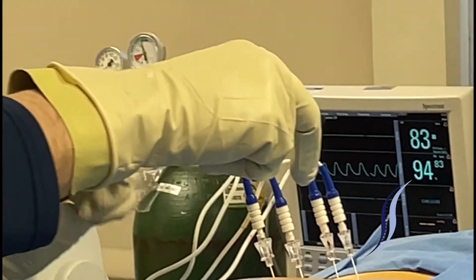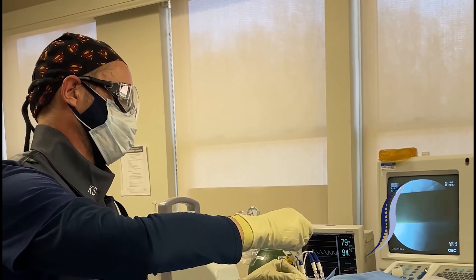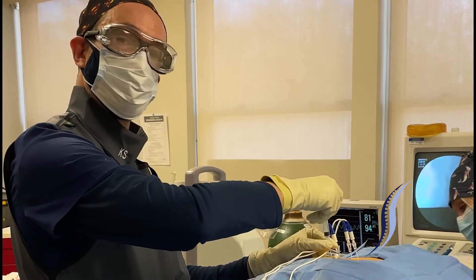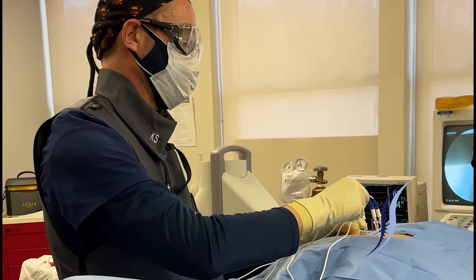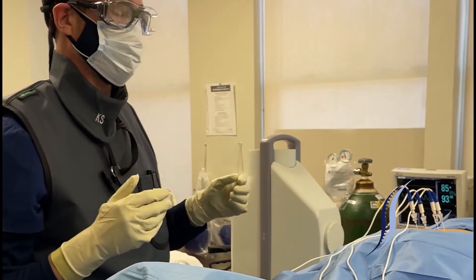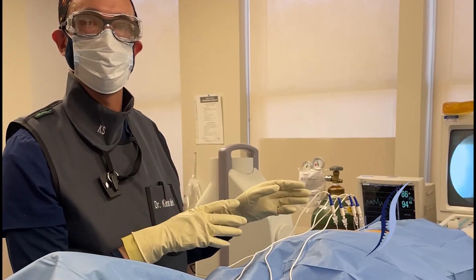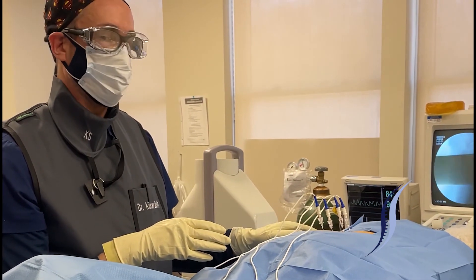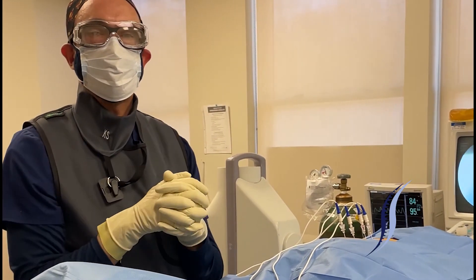Having a pulse oximeter on your patient allows you to monitor not just the oxygen saturation but the heart rate simultaneously. This can alert you to early signs that the patient is going to have a vagal episode, so that you can take intermediate reactions to prevent any significant sequelae. What we do now is wait for 90 seconds to allow this 2% local anesthetic to take its effect at the level of the dorsal rami, then we're going to have an ablation that will also take 90 seconds.